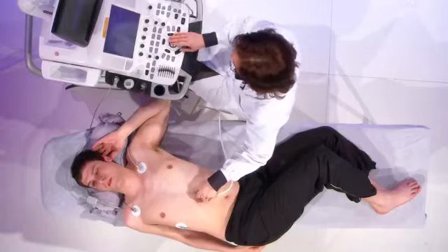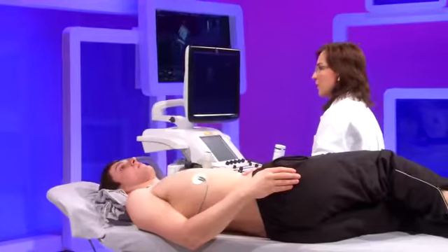So after this overall examination, I would conclude that the mechanism in this case of the tricuspid regurgitation is a functional one, and there are no criteria of severity, so we can conclude a moderate tricuspid regurgitation. Again, this conclusion does not come from a single number, but from integrating information from morphology, Doppler, and continuous wave Doppler, and also related to the size and the response of the inferior vena cava.